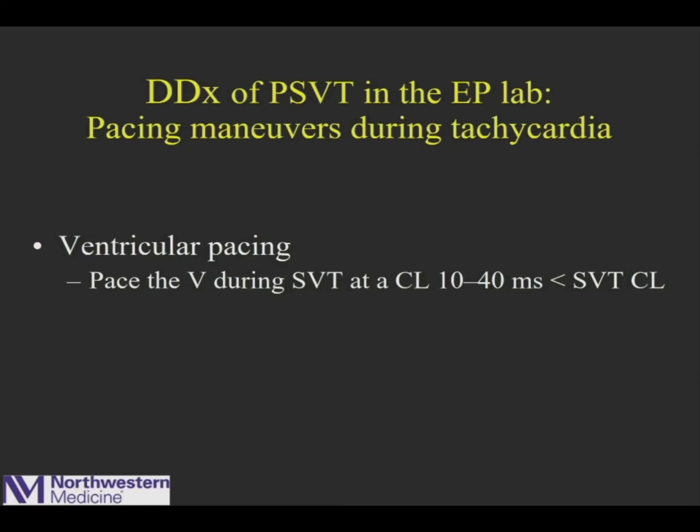However, in the interest of time, I'm going to talk about just ventricular overdrive pacing, and Jeff showed the case of the value of that. I like this maneuver because sometimes you don't have a lot of time. The tachycardia will initiate, and it will often spontaneously terminate after 20, 30 seconds. If you can perform one maneuver, you have one opportunity, then you want to perform ventricular overdrive pacing.